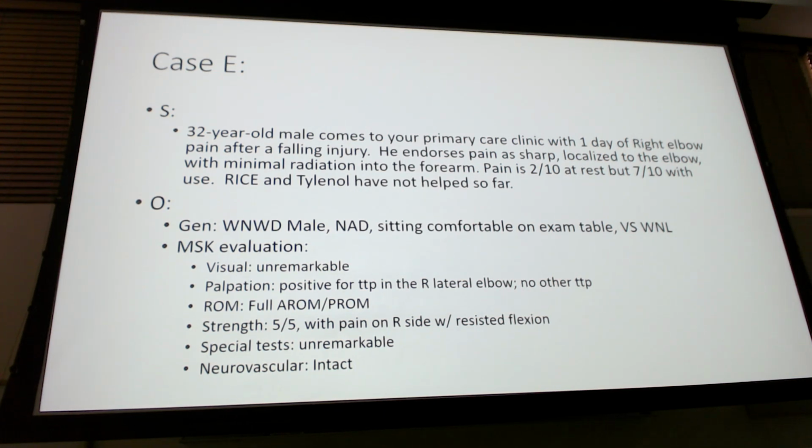What you do need to know, though, is anything that I distinguished as weight bearing, right? Definitely weight bearing versus non-weight bearing. Lisfranc is a perfect example, right? Because if you don't know to order weight bearing, and you order non-weight bearing, you're going to miss it. Those are the kinds of things, the AC joints, right? If you order them incorrectly, you're going to miss the abnormality. So those few things where you need to do this to see the abnormality, that would be fair game. But other than that, I'm not going to make you pick between a sunrise view of the knee versus an AP view of the knee or something like that, right? We didn't really get into that too much.